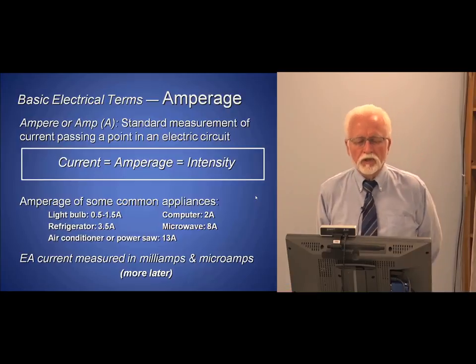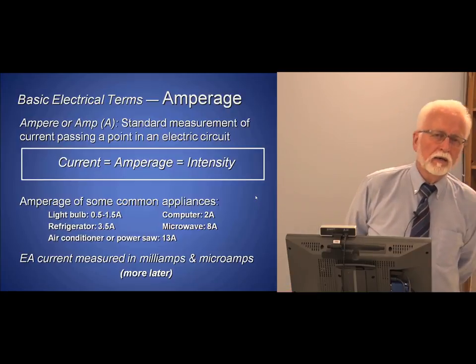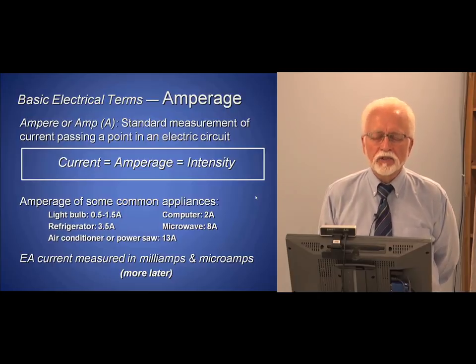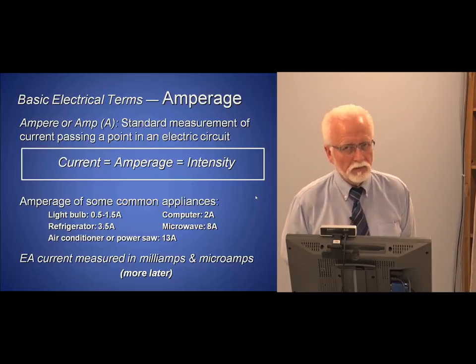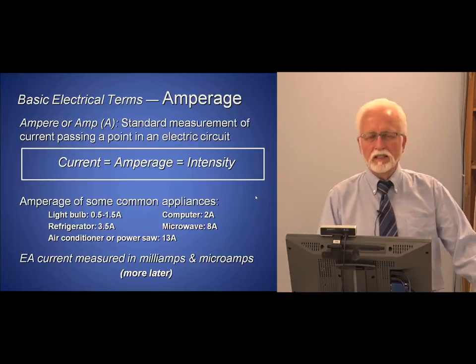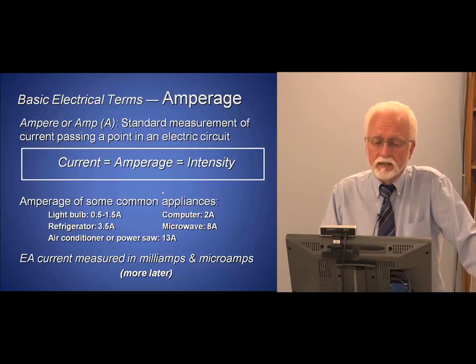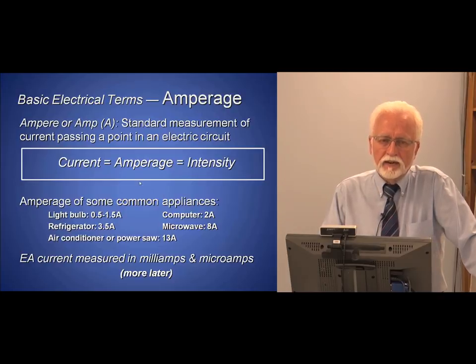But the devices we're using are talking about milliamps and microamps. So they're tiny, tiny amounts. You could not light a light bulb with a millicurrent device or with a microcurrent device. You can't have a lot of effect, but the patient can feel it. And so they're very safe in that way because they won't go too far. They won't shock the patient. They won't light them up.